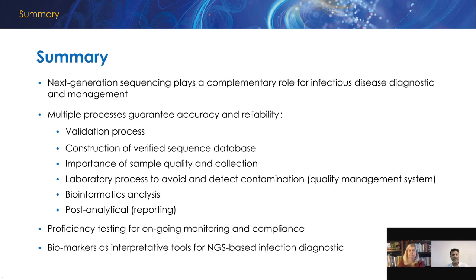So laboratories have a series of quality control processes so that when the result is released, we guarantee that those organisms were not introduced on the laboratory side. Now, the other variable is whether they were introduced during the collection. And that's a highly probable source too.